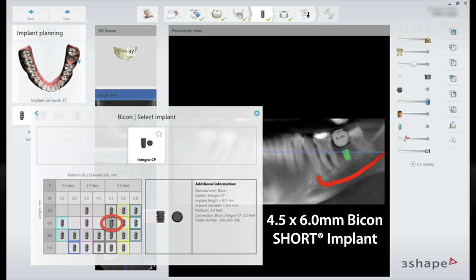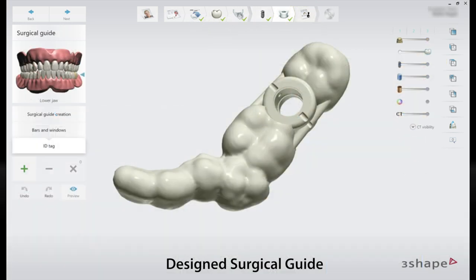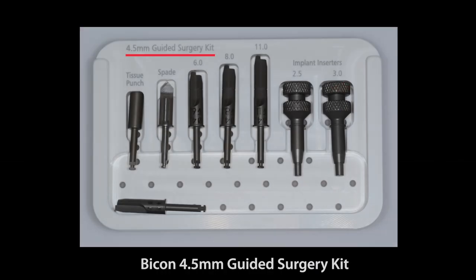Virtual insertion of implant 4.5 by 6, then selecting a 4.7 millimeter Bicon ring. This is the design of the surgical guide, then the drilling protocol showing the implant order number and the minimum drilling depth. The use of a short implant in this case allowed the guided placement of implants in the posterior region of a patient with a limited mouth opening.